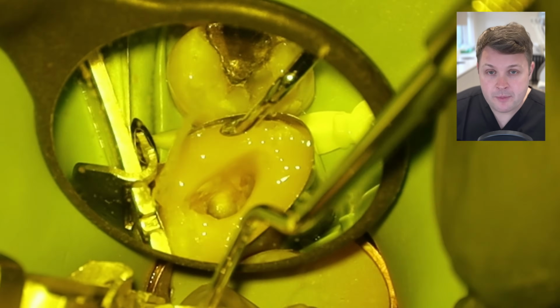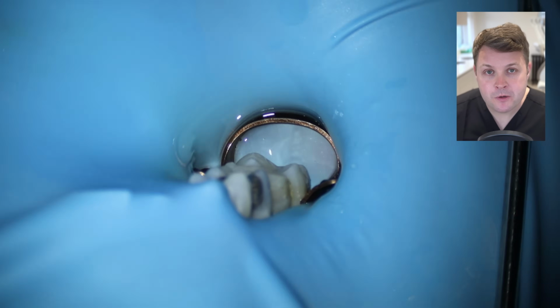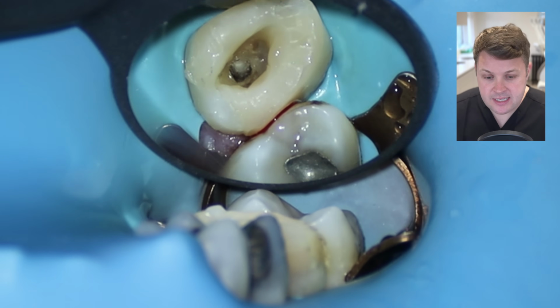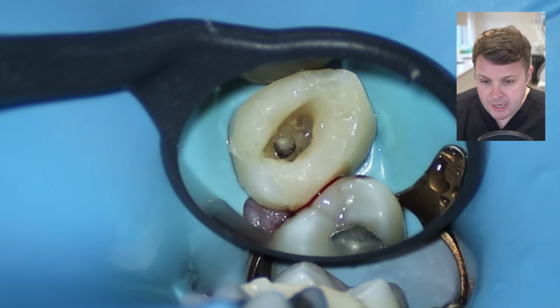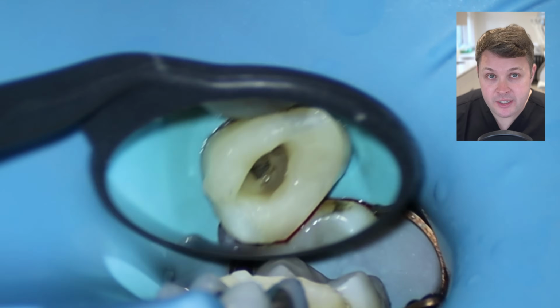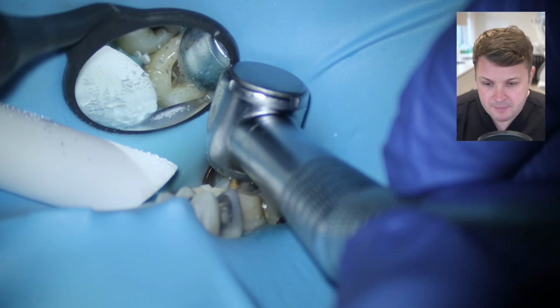And now when we give it a bit of a polish up and have a little look at the restoration in place, it looks all right. It doesn't look too bad. It's not perfect, but don't forget this tooth's going to have a crown on it eventually. This is essentially just to get the patient over the line till they do get a crown, and also it's going to create a kind of a cup or a bathtub ready for us to put our irrigants in. Because if we were to use the irrigant and the filling wasn't in place, then it'd get everywhere and the patient might taste it in their mouth.